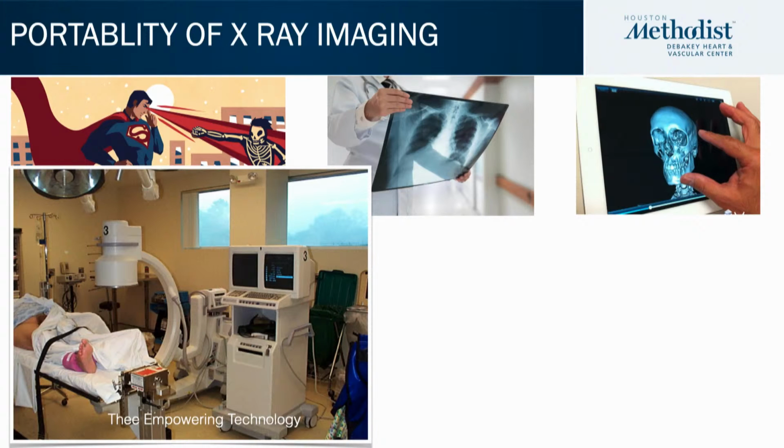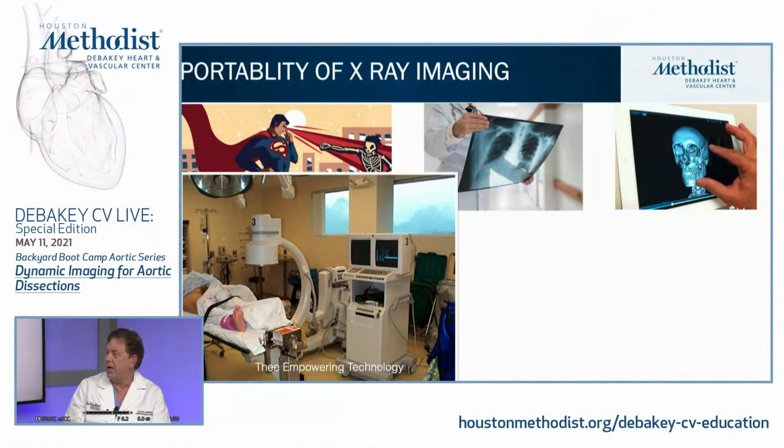That table was actually stolen from the neurosurgeons because it was used for X-ray imaging doing spine procedures. You can roll the patient completely on the face. And that OEC C-arm at that time was state of the art because it allowed us to do digital subtraction angiography. That's really what got vascular surgeons in the game. That's when we became imagers.